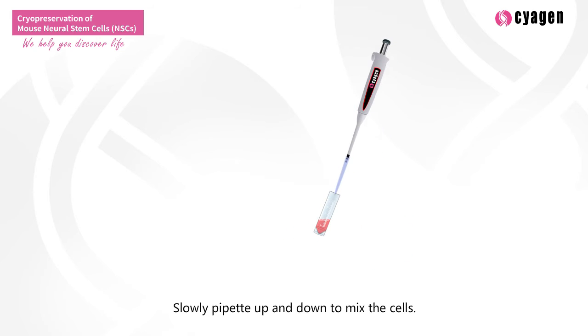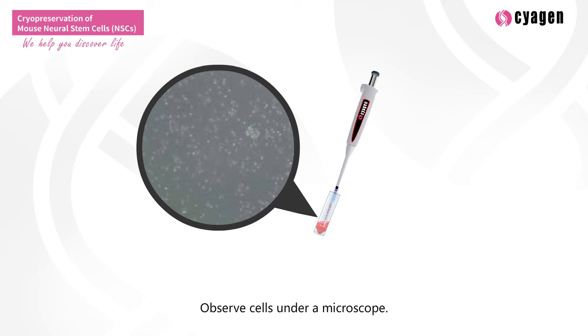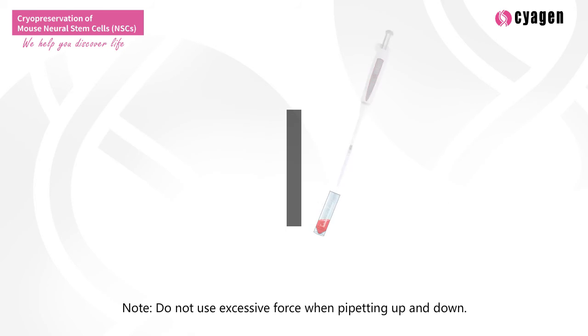Slowly pipette up and down to mix the cells. Repeat this step 10 to 20 times to obtain a uniform single cell or near single cell suspension. Observe cells under a microscope. For larger culture volumes, aliquot cells into 2 to 3 Eppendorf tubes before pipetting. Note: do not use excessive force when pipetting up and down.